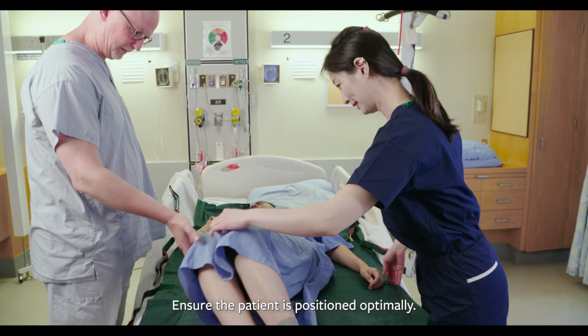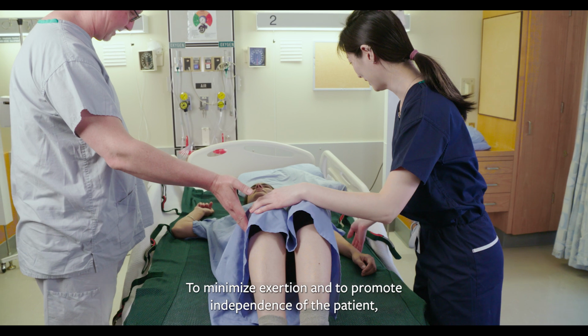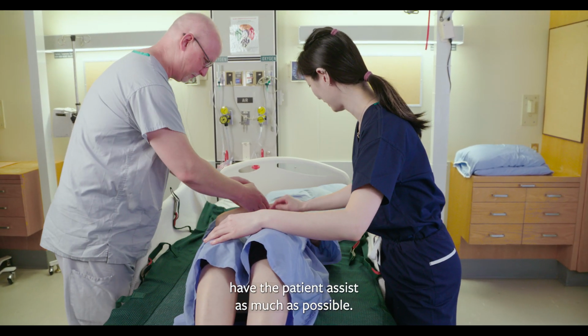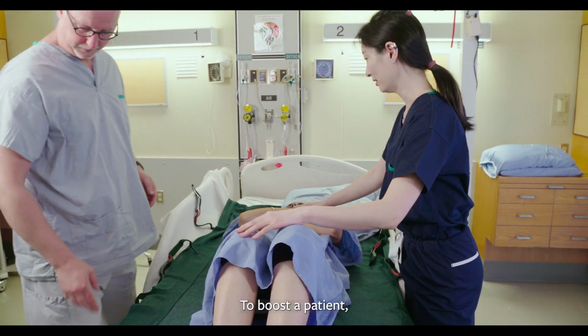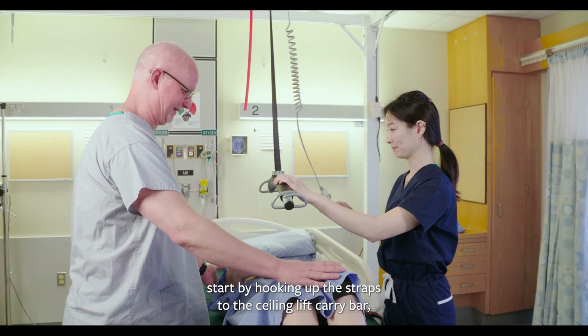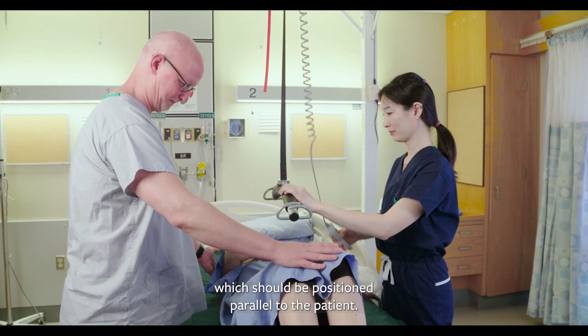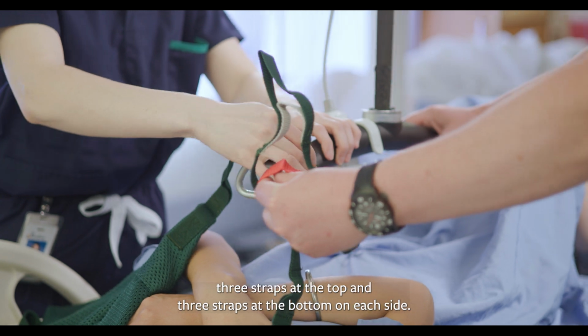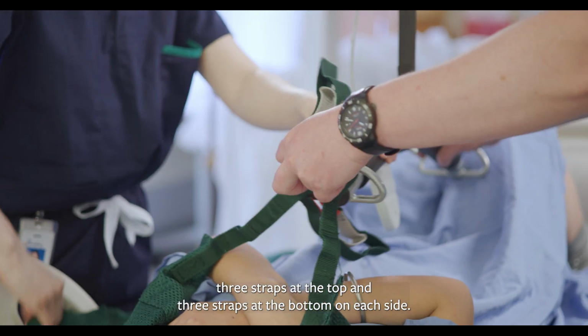Ensure the patient is positioned optimally. To minimize exertion and to promote independence of the patient, have the patient assist as much as possible. To boost a patient, start by hooking up the straps to the ceiling lift carry bar, which should be positioned parallel to the patient. In most cases, you will be hooking up 3 straps at the top and 3 straps at the bottom on each side.